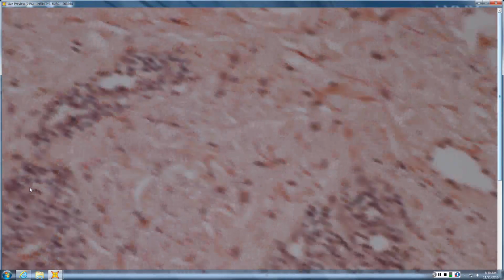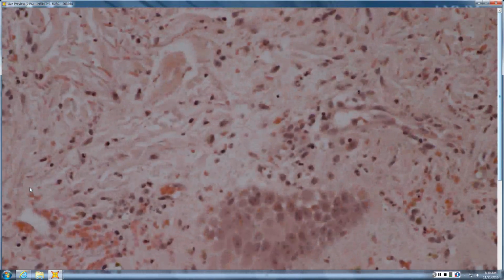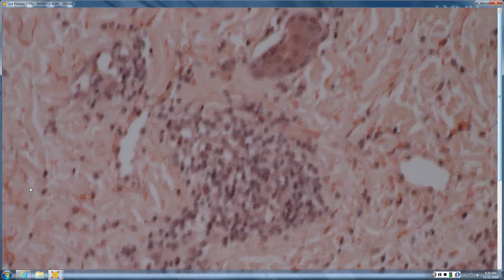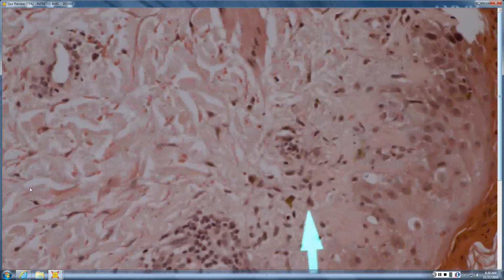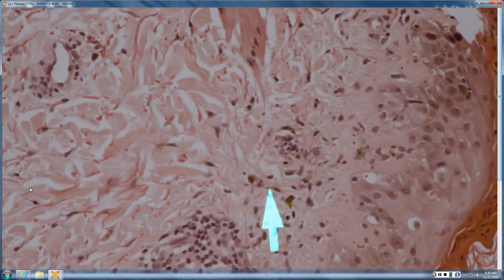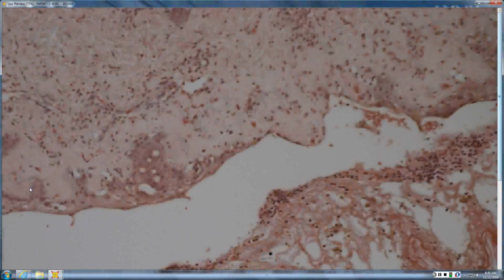We look down in the dermis and we look for papillary dermal fibrosis. Don't see a lot of that. Look for deeper pigment. I see some pigment that's down around vessels. So that suggests the possibility of fixed drug. So this one you'd look at the patient.